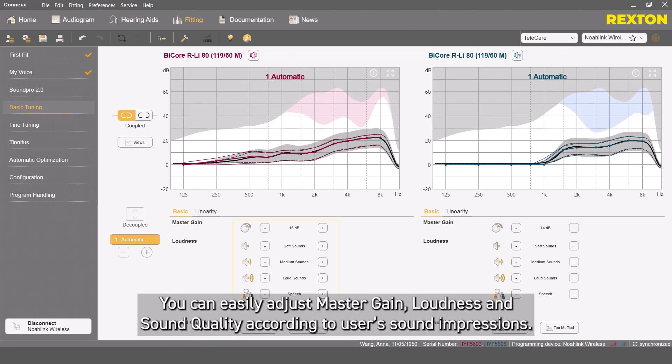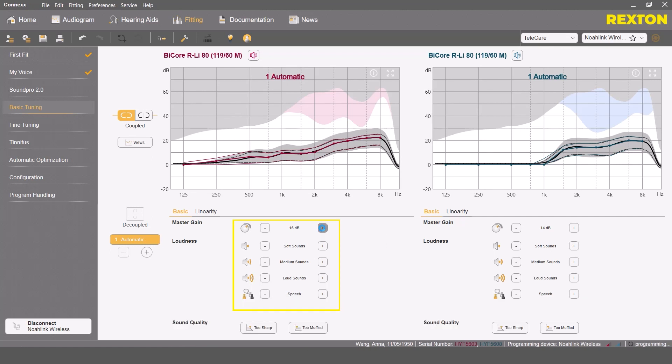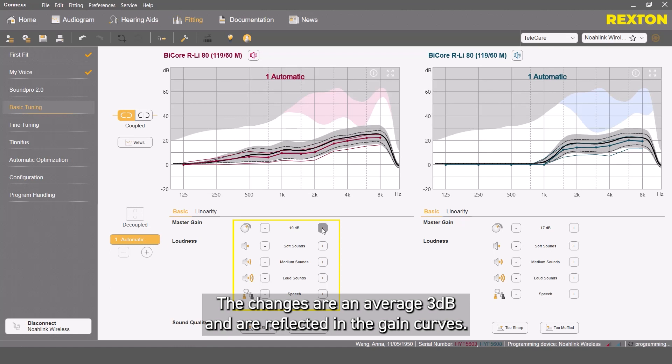You can easily adjust master gain, loudness, and sound quality according to the user's sound impressions. The changes are an average 3 dB and are reflected in the gain curves.